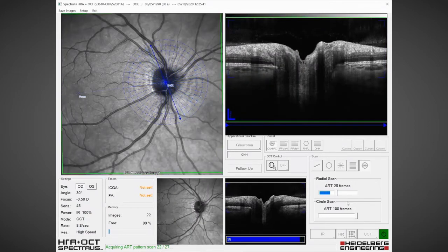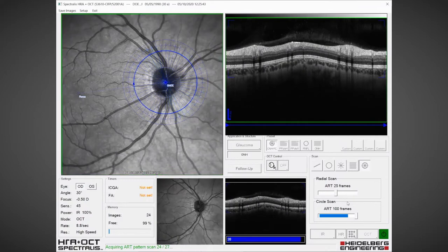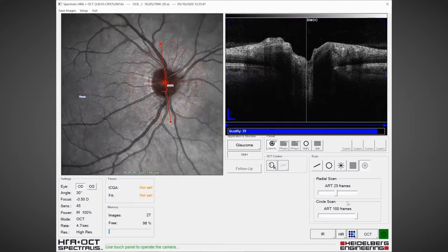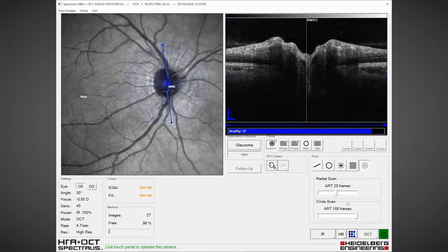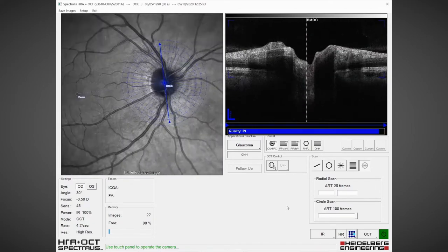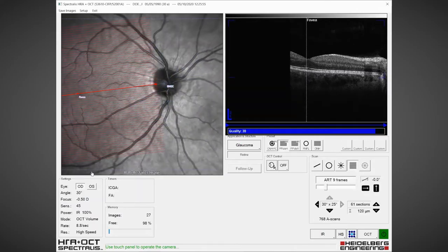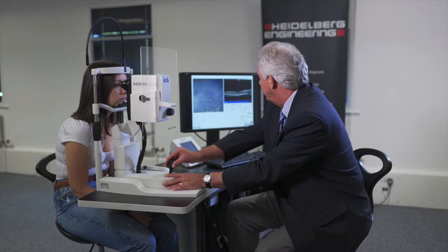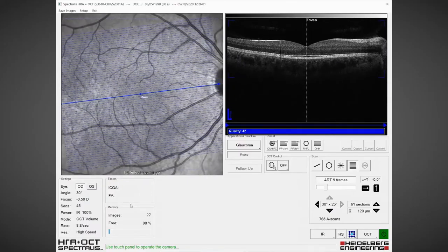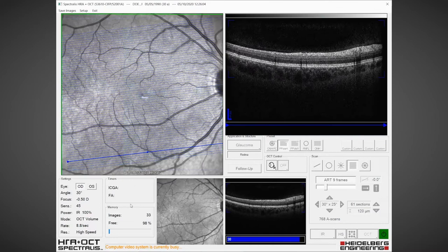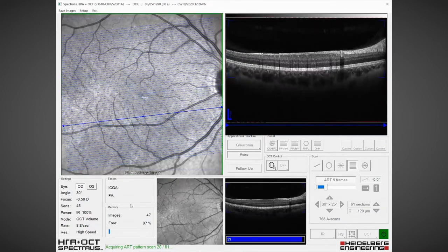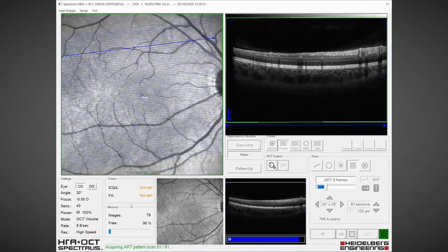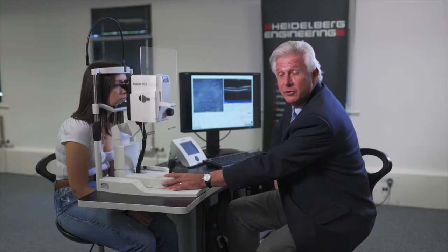Then we're going to do three nerve fibre layer circle scans: one at 3.5mm, one at 4.1mm, and one at 4.7mm. We complete those, then we do the posterior pole scan to look at the whole macular area. I acquire the image with ART9 — an averaging of nine scans per B-scan — and then we can segment all of the layers and look at the ganglion cell layer.